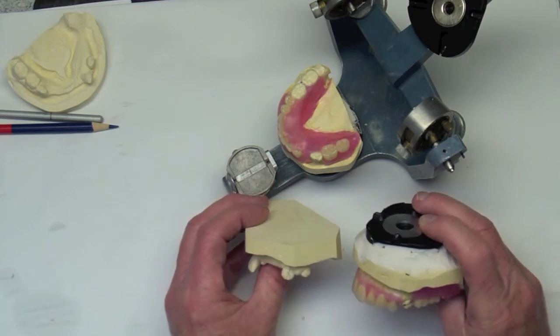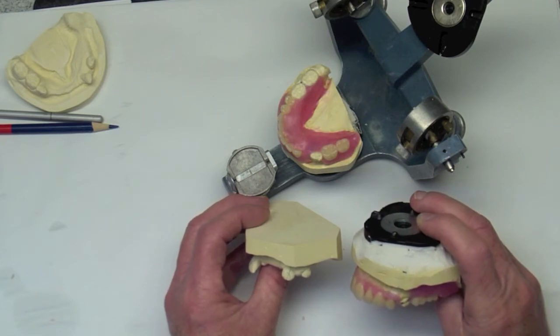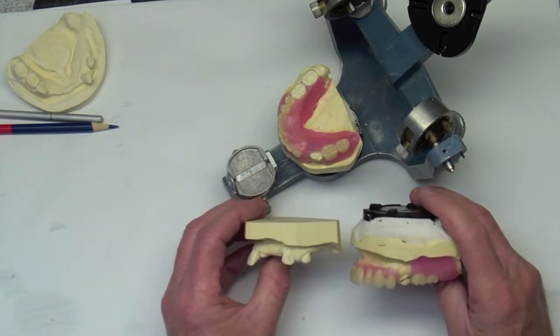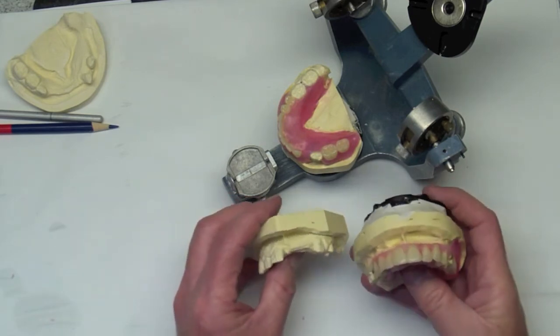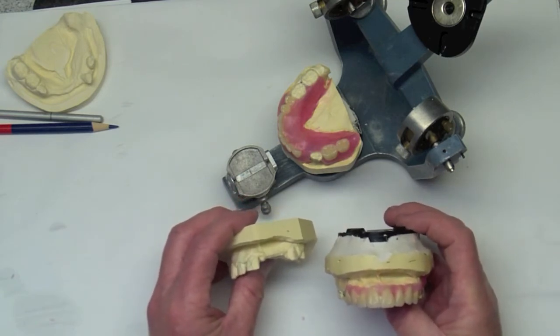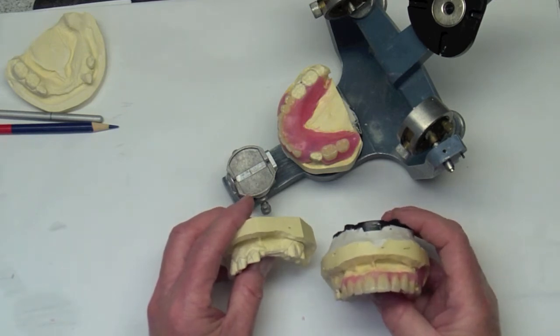And hopefully, we can manage some of the lip incompetence associated with this excessive flaring to the anterior teeth and the maxillary excess. So as I said, this is just going to be step one and then, following adequate healing, we'll go ahead to the next step which will be the fabrication of the maxillary mandibular complete denture.